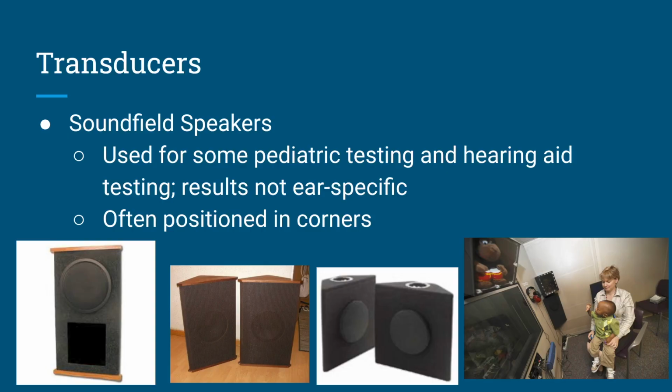So sound field testing is the more accurate term, but sometimes they call it free field testing, which is a less accurate terminology, but used almost synonymously. There are many different models of sound field speakers used for testing pediatrics where they cannot tolerate earphones, or if you're testing in the aided condition, like aided versus unaided with hearing aids or cochlear implants. That's another example where you use sound field testing.